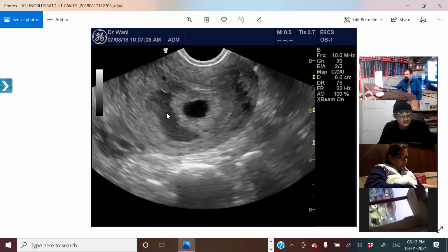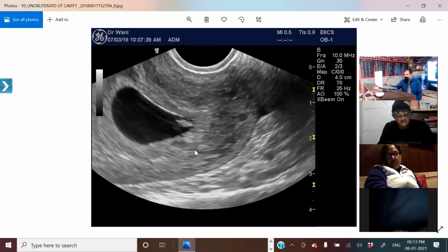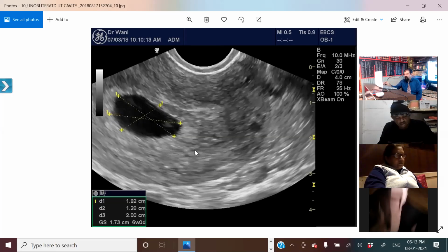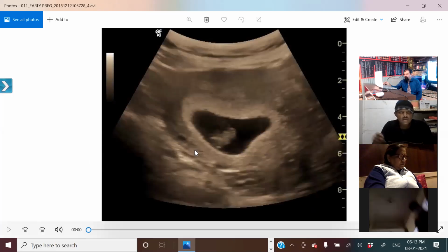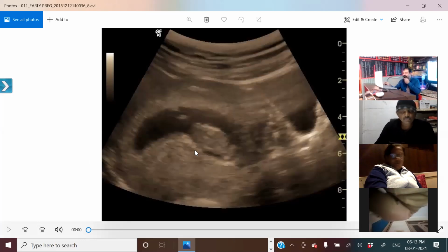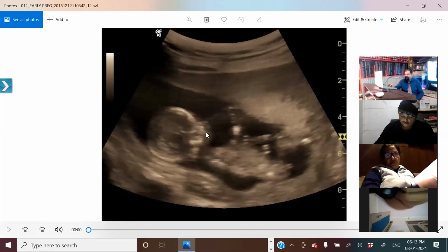Okay, so again showing you the detachment. This is the detachment. This is the detachment. Now see, this is the chain.